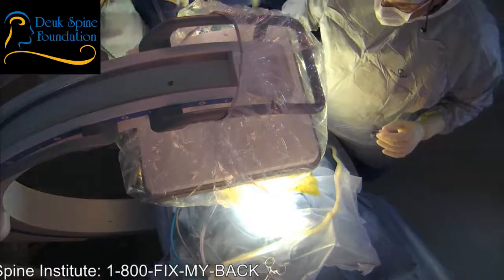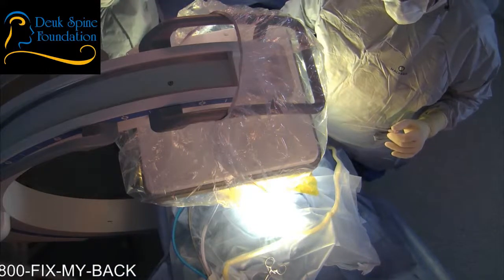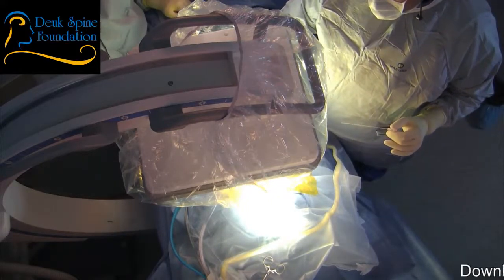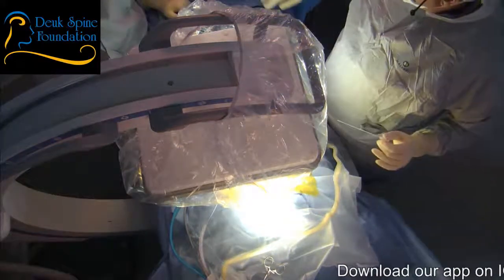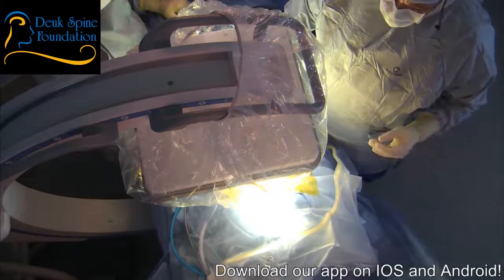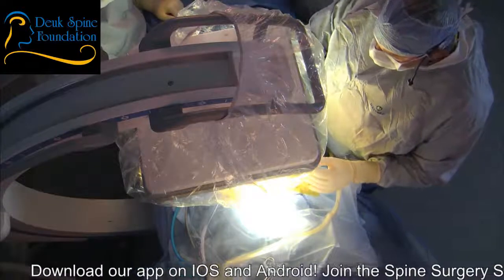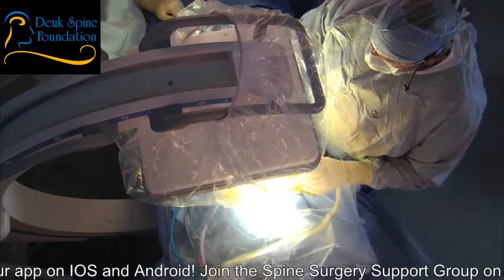All right. Are you comfortable where you are? He's uncomfortable? What's wrong? How can we make you more comfortable? Huh? Something under your ankle? Oh, you feel something squeezing your leg? That's a leg squeezer. That's to keep the blood circulating up your leg. So not much I can do about that. We'll try to get this done and get you asleep as soon as possible, okay? All right, so just bear with me.